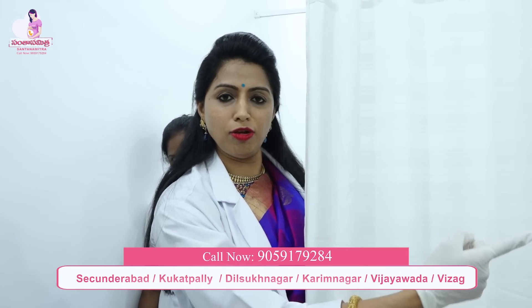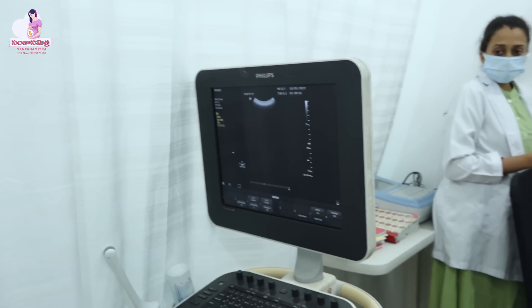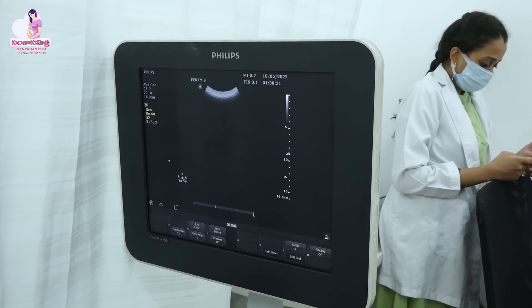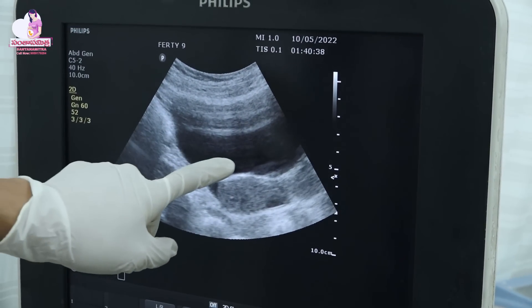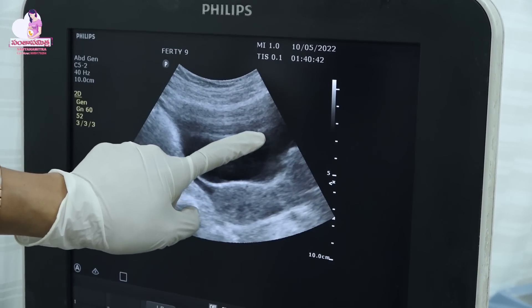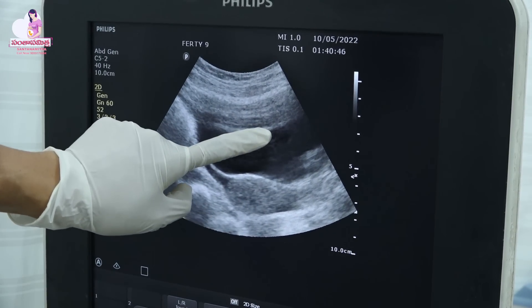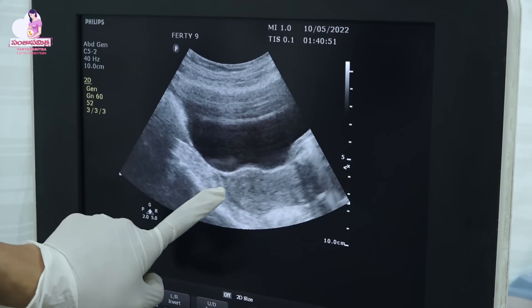Now you can see the scan. Here you can see it. This is a bladder — here you can see the urine bag. The documents are done. We have collected the speculum. Now, in this point, the speculum has been placed. We insert it into the uterus — we insert the IUI catheter into the uterus.